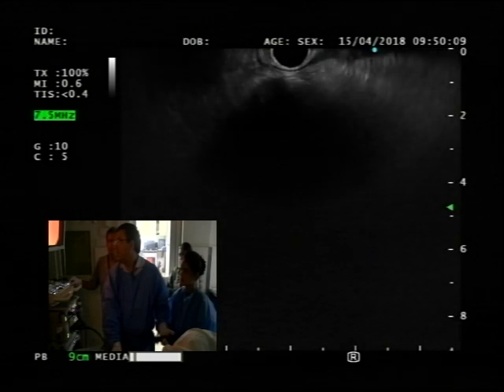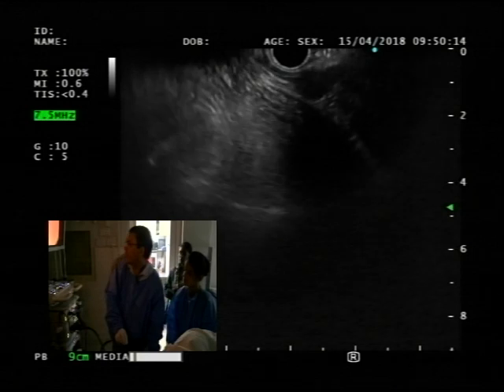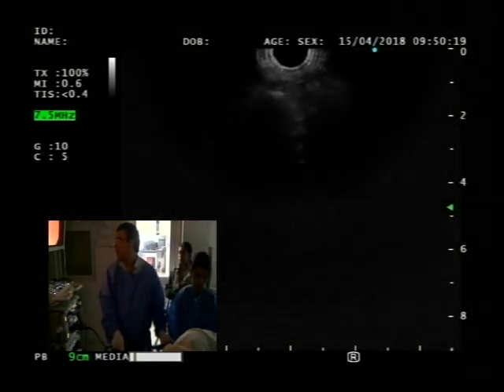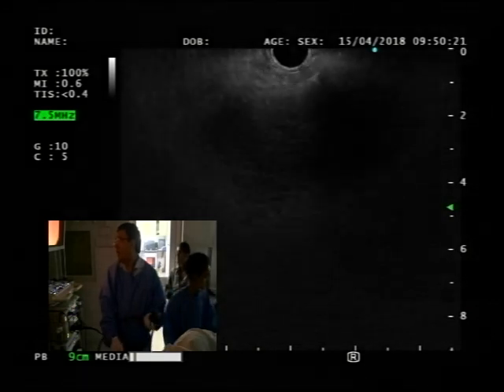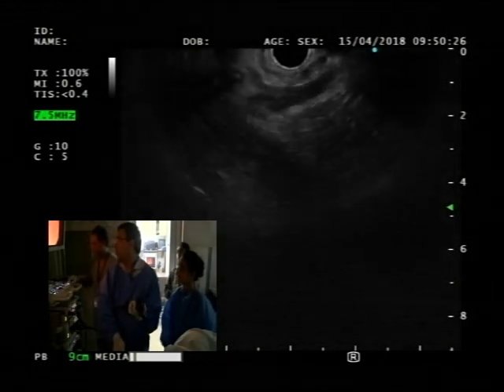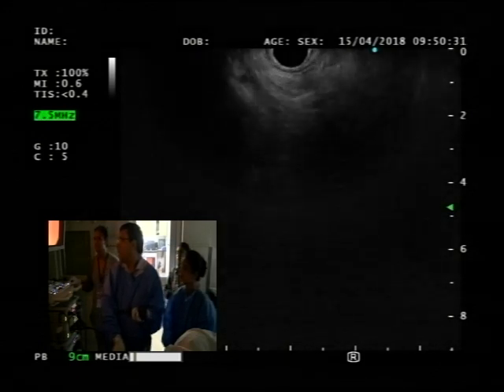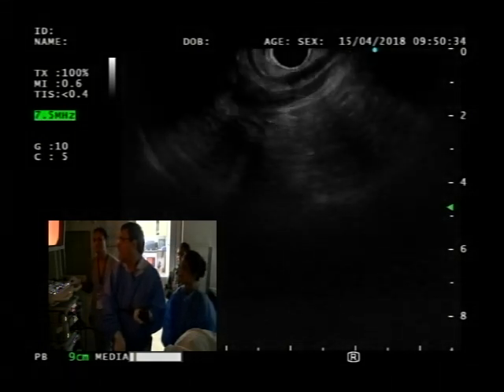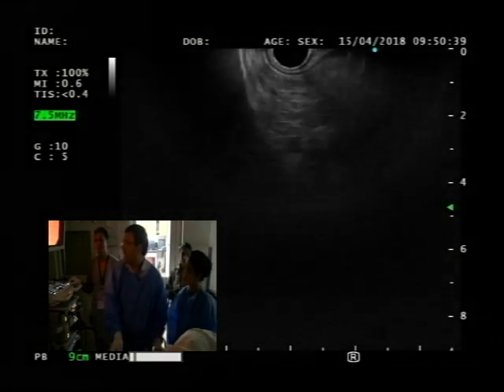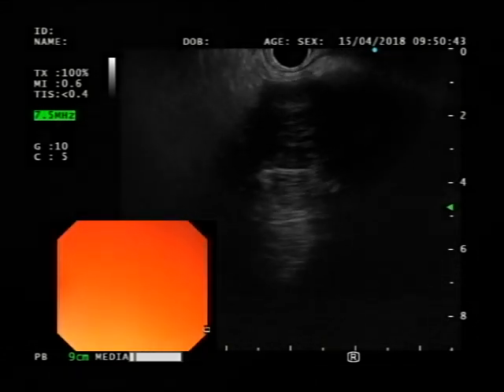Okay. So here, I'm seeing a shadow of the spine right there. Vessels, nothing there, and still coming back. So I'm just moving my scope around and going 180 degrees. Right now I'm looking for basically the lymph nodes if I see anything, and towards the end, you're just sweeping around the clock, a 180 degree sweep around.